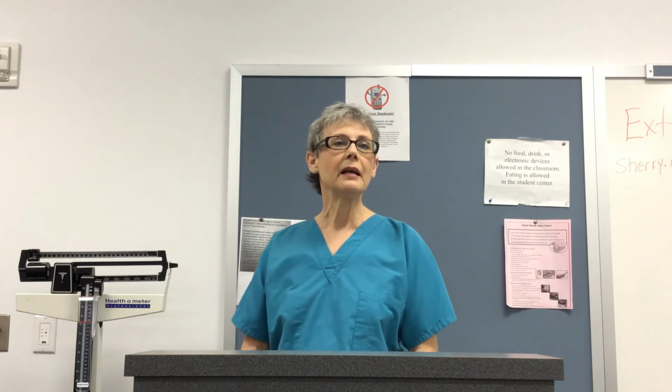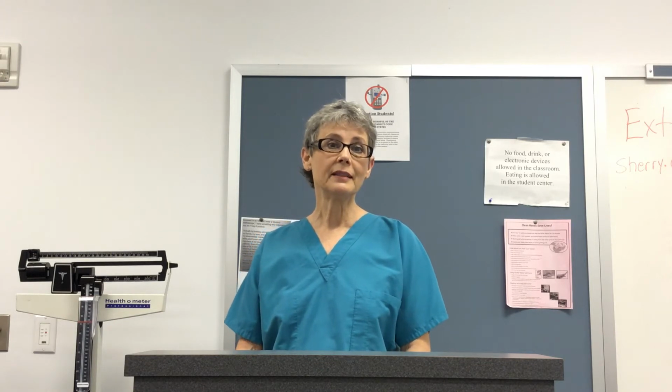We talked a bit about intermittent or continuous infusions. You would need to know that because when you're preparing your supplies, you'll need to know, do I need to take a bag of normal saline to hang with this intermittent IV medication, or will it be continuously infusing?